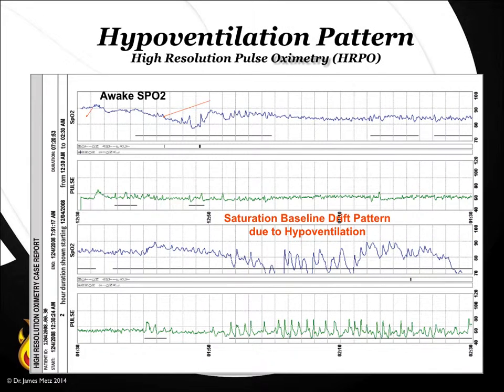Hypoventilation is different. You'll see kind of a wave pattern. You see how the SpO2 is kind of wavy on this one? Well, if you don't have an actigraph built into the oximeter and screen with a tenth of a percent, this hypoventilation pattern a lot of times will not be evident, because oximetry gets a drift to the baseline, but it's just part of the machine error. And with this one, when you get a drift, you know there's a true drift.